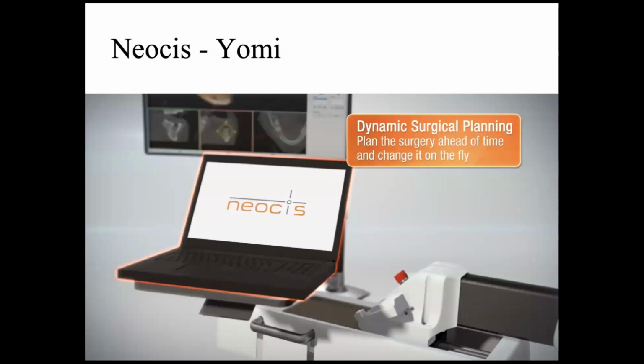So you have what we call dynamic surgical planning, and that's the biggest benefit of Yomi. Sometimes during surgery, if I go somewhere and I don't get the bone that I want for an implant, I can on the fly change the position in the surgical planning, and then Yomi will actually change the drilling protocol.